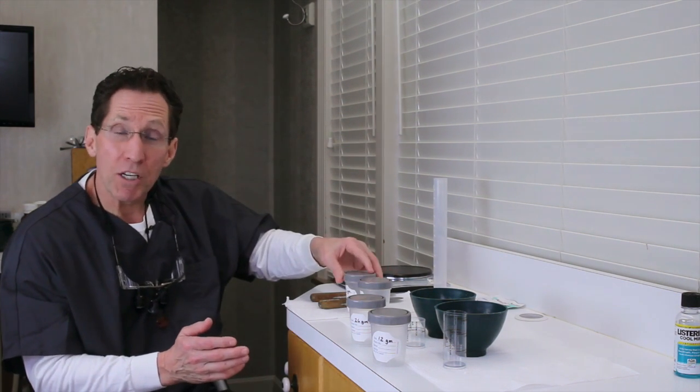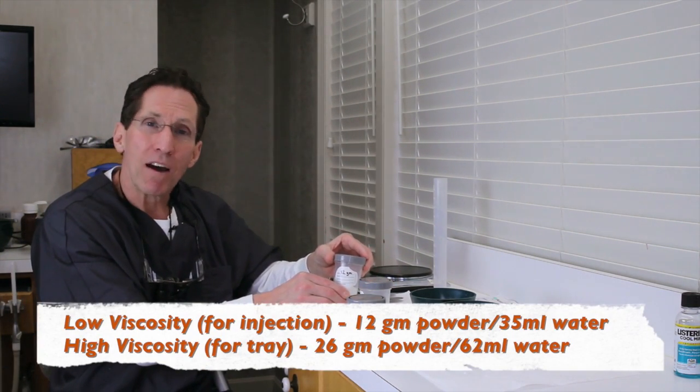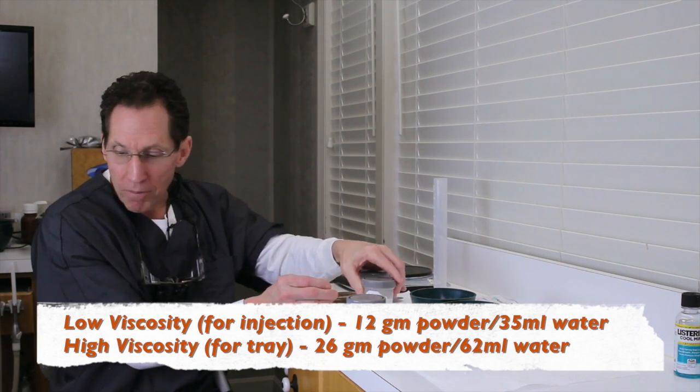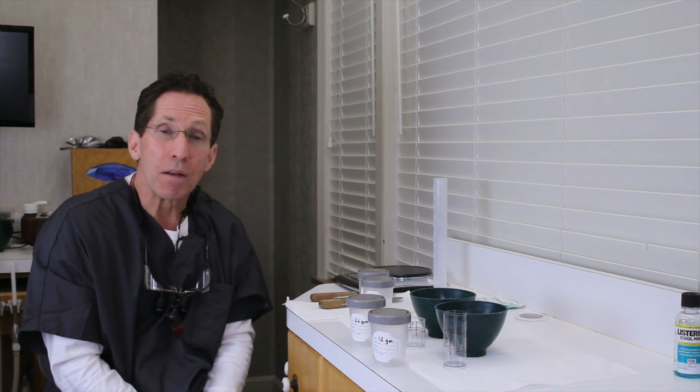And from my experience, my starting point is we have 2 mixtures. Our low viscosity is going to have 12 grams of powder and 35 milliliters of water. Our high viscosity or tray material is going to have 26 grams of alginate powder and about 62 milliliters of water. Now, I would recommend trying that as a starting point. And these numbers are, again, referenced at the end of the video, so you don't have to worry about writing them down. But I would begin starting there. And if you like, you can modify them.